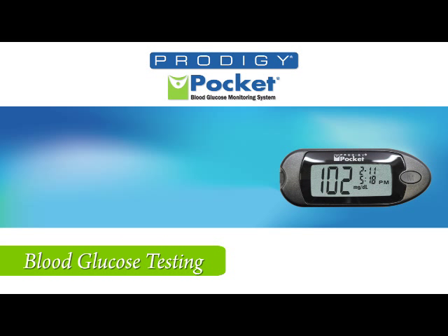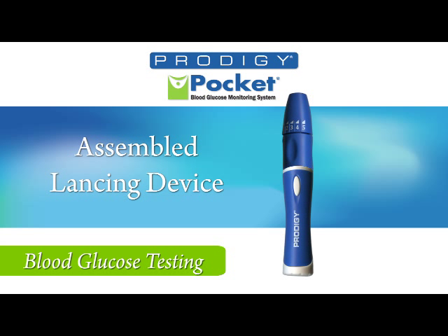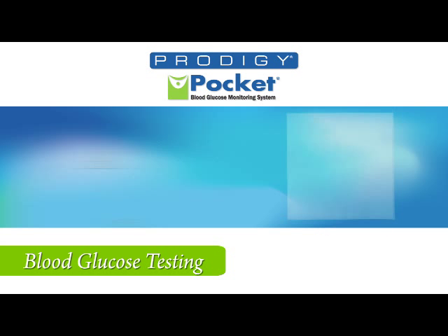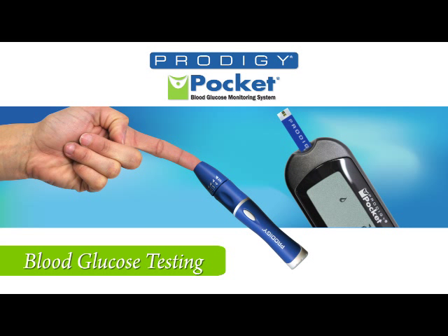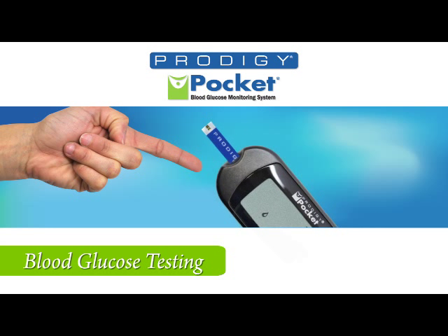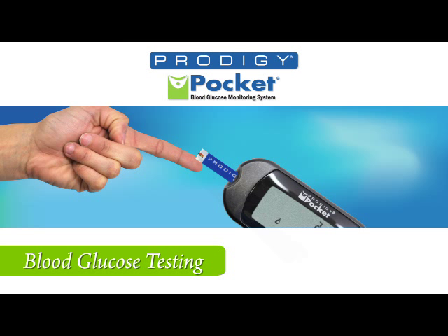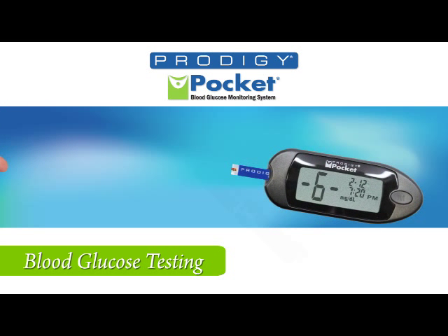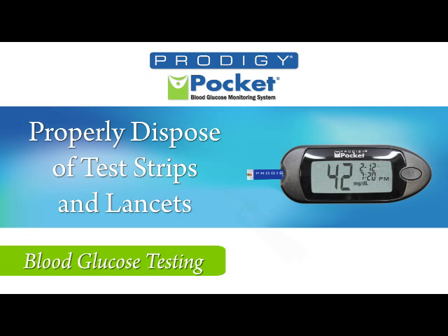Now you are ready to perform a blood glucose test. You'll need your Prodigy Pocket Meter, your assembled lancing device, Prodigy No Coating Test Strips, and a tissue. Insert the test strip into the test strip slot. Puncture your finger with the lancing device. Wipe off the first drop and apply the second drop to the test strip. When the absorbent opening is full, the meter will beep. Your meter will count down from 6 to 1 and show the result. Discard the test strip and lancet according to local regulations.